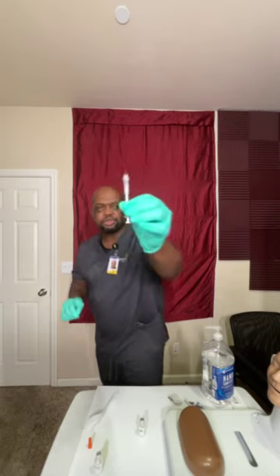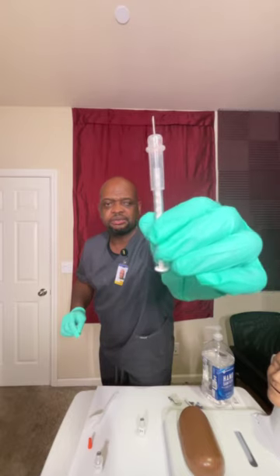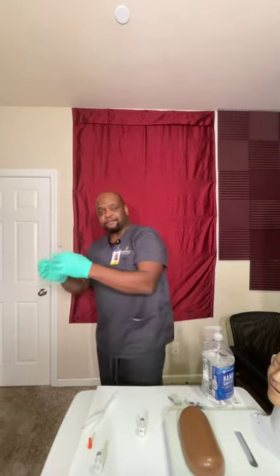So I'm going to actually show you those units as well. So you can see, right? 4 units, right? Let me make sure you can see that there. Okay, 4 units. Good. All right. Now, we're going to check it against the medication administration records, making sure that the 4 units are proper. The nurse confirmed it. I confirmed it.